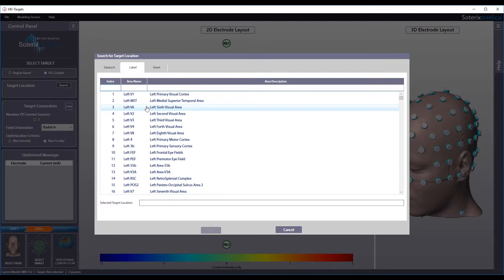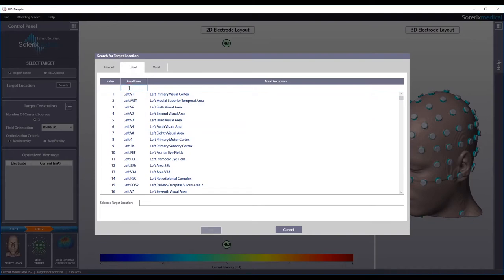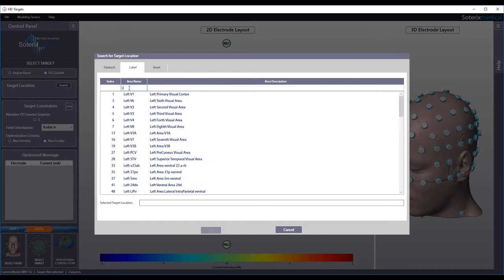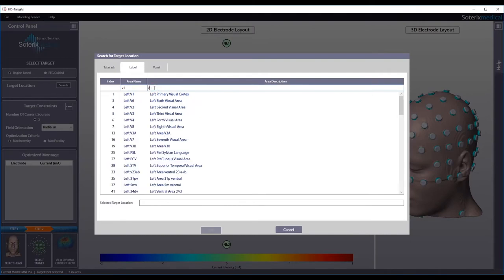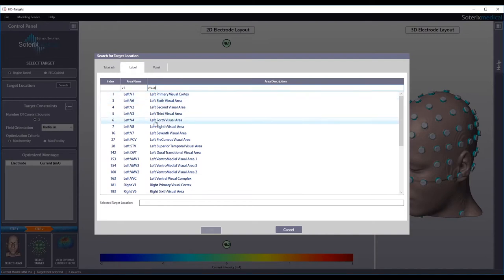In this option, you can perform a label search either by index number on the top left, or by area name in the middle, or by entering a target description keyword on the top right. For instance, entering area name V1 results in 4 hits, or entering description keyword visual results in many hits. Select the region you are interested in and hit OK.